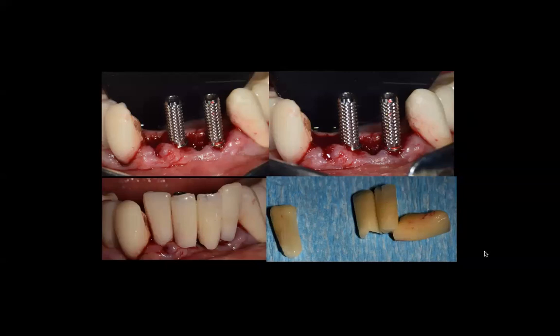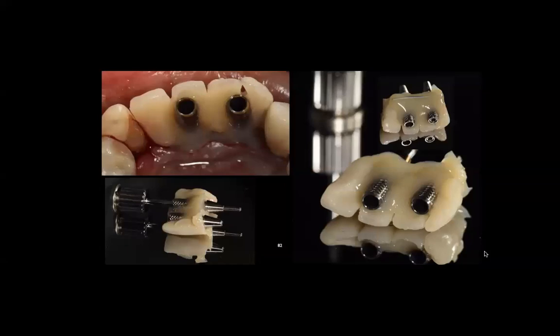It just completely shattered. Now I have these pieces of acrylic laminates that I need to work with to create the temporary and reline. So it makes your life a little bit harder and more difficult. You have to tell the laboratory to build that area up. So take a look over here, see what I did.